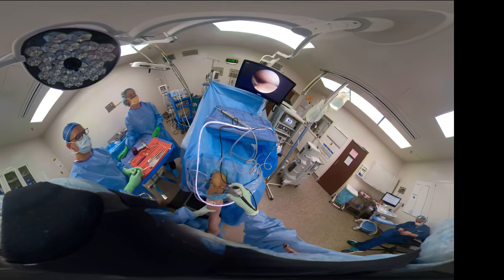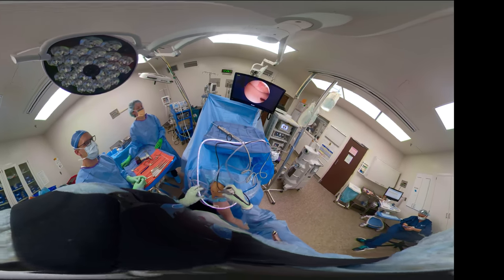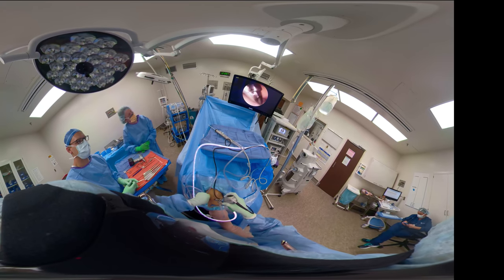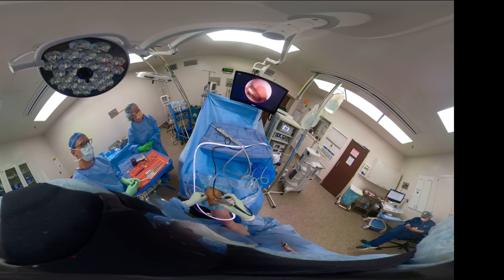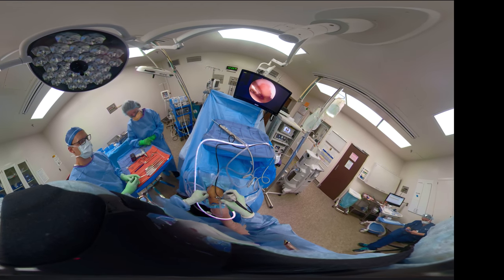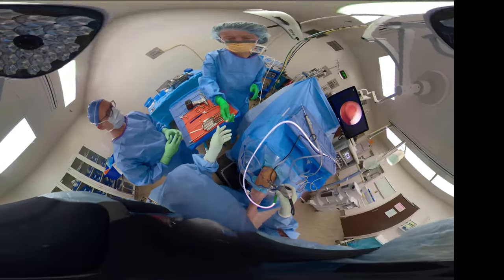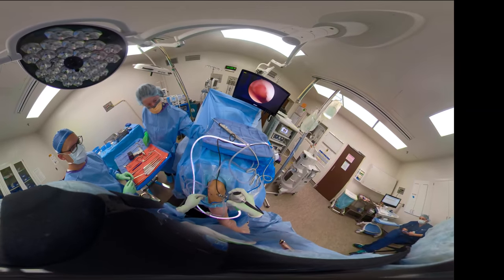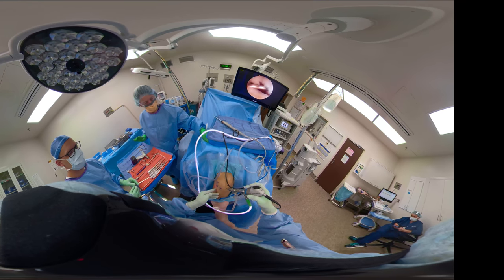So now I've got the cannula with the blunt obturator in the lateral portal, and we have to be perpendicular to be able to do the drilling. So if you see, we're very parallel there, so that does not allow us access to do the microfracture. Localizing this with a spinal needle with the knee in flexion is then done so that we can get perpendicular. I like to hold the needle back at the back, away from the tip of the needle.